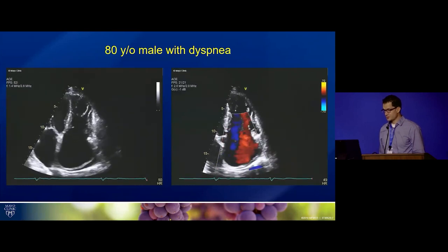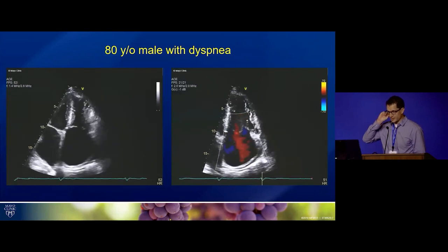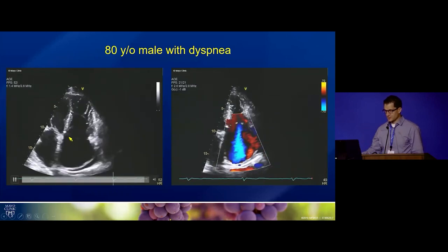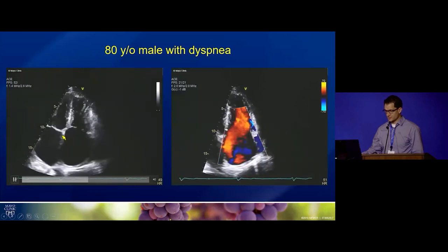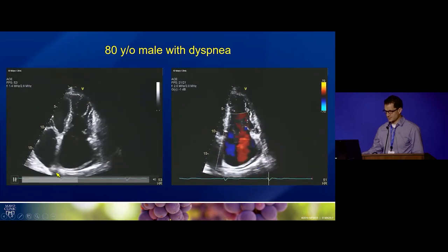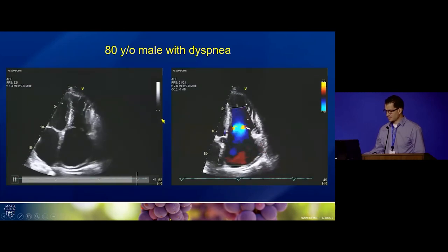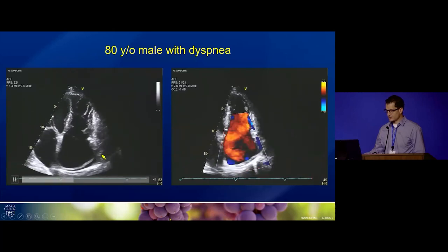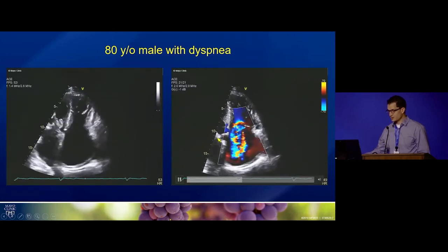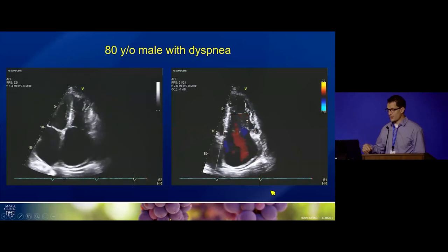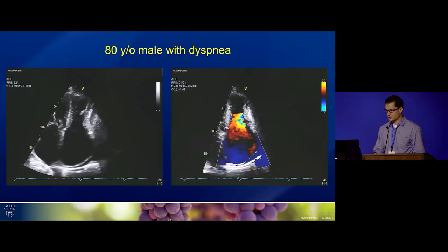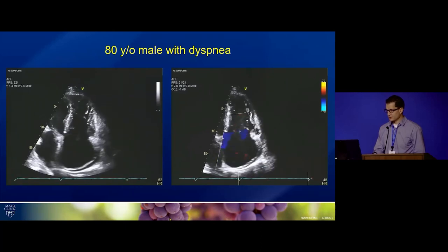These are the apical images in Mayo format, so the RV is on the right. The tricuspid septal leaflet is usually more apically displaced, confirming this is the right ventricle. There's a huge right atrium and a sliver of pericardial effusion. You see a very broad jet of TR. When TR is wide open like this with laminar flow, we can actually underestimate the amount of leakage, but clearly there is a lot of tricuspid regurgitation.